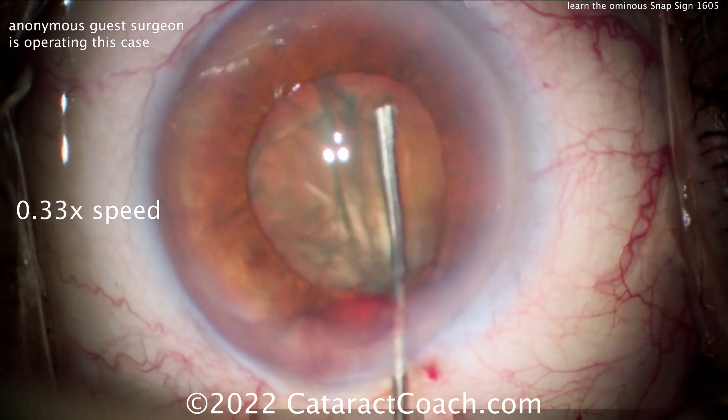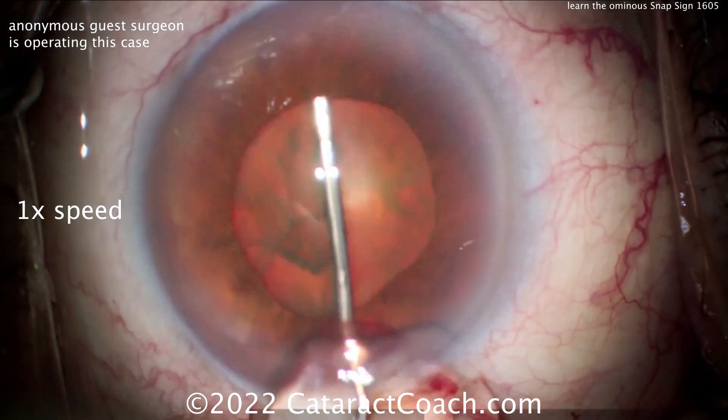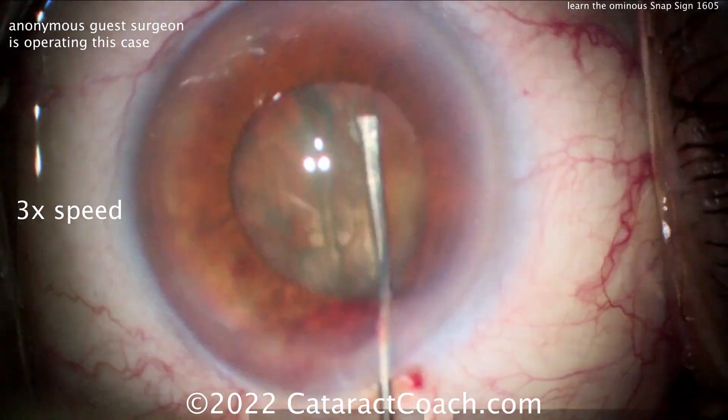Now, this is one of the reasons why I like to do the hydrodissection from the side. The cannula here is blocking the nucleus from coming up — boom, there's the snap. It's done. The posterior capsule at this point is wide open.